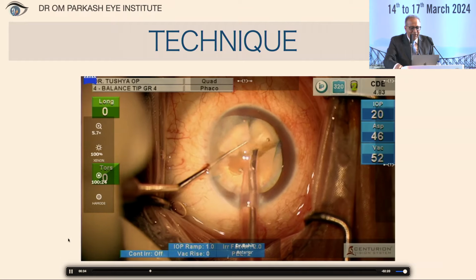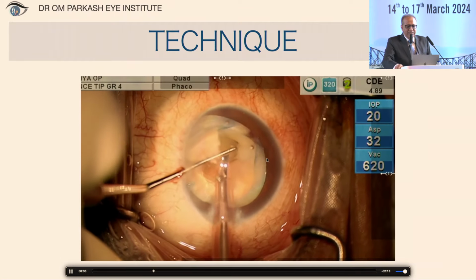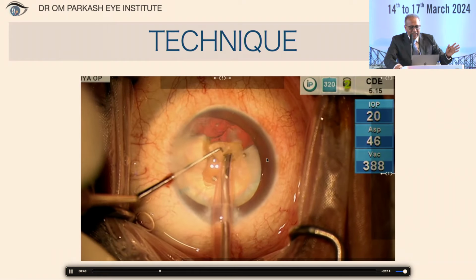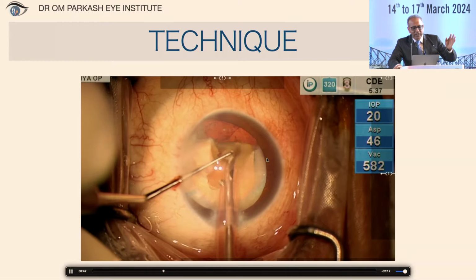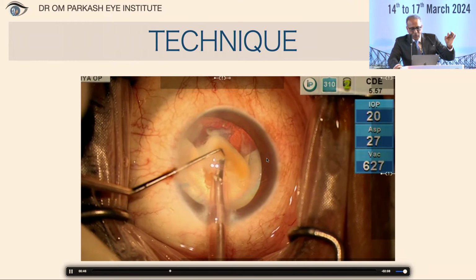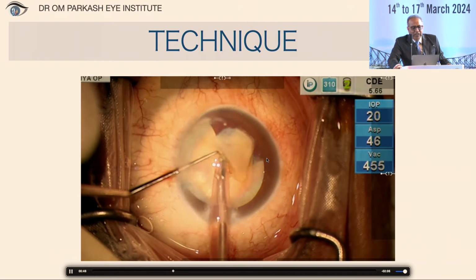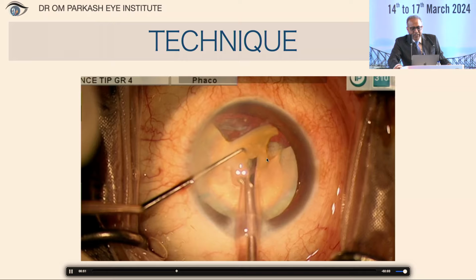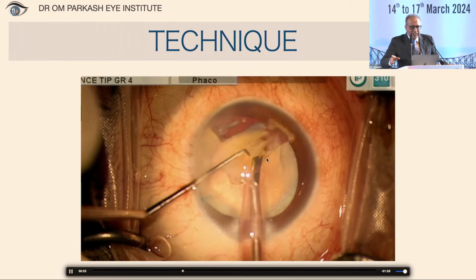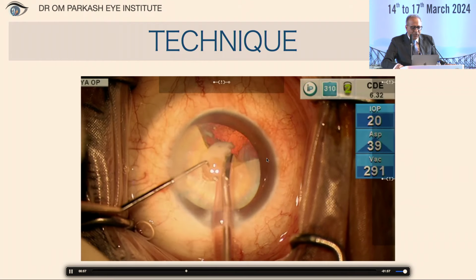Have a look at the flap. It is still fluttering. So this means the maneuvers which you are using are not insulting the end point of the flap where it is. So you can see how I am continuing. I am doing emulsification at a slow motion. You will see that it is coming, it is sticking onto it.